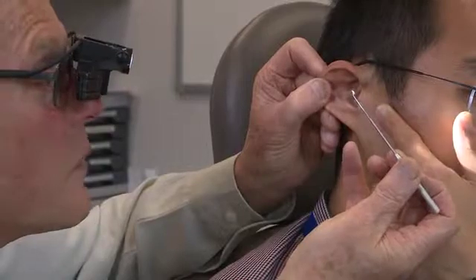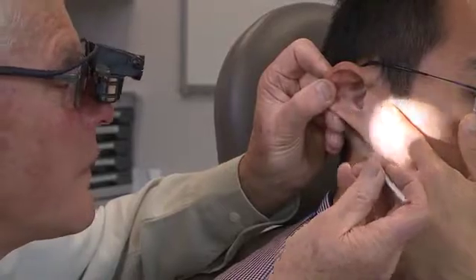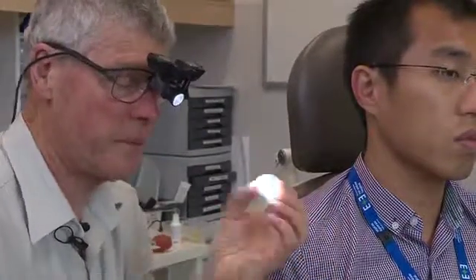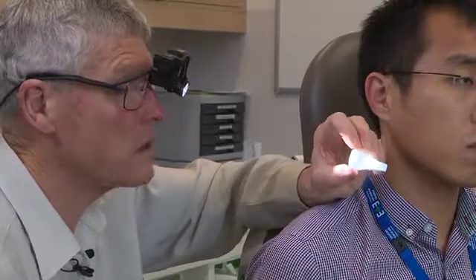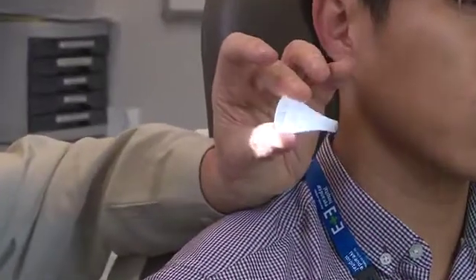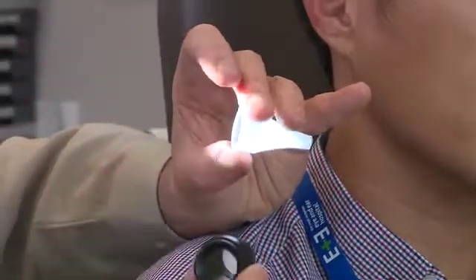That, of course, would have been completely unnecessary — a symptomless bit of wax, but no pain at all. We'll just talk briefly about ear speculums. The one that seems to have gone furthest back in history is that shape — it's got a name, Gruber, I presume it's German. A lot of them are still around the hospitals and they're made of brass. One of the reasons they're shaped like this is you can plug it into a puffer, a pneumatic otoscope. This isn't used as often as it should be.